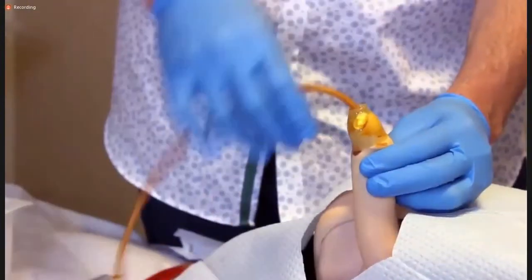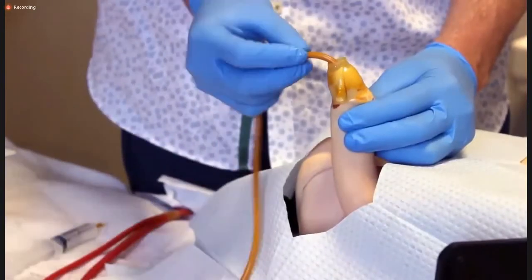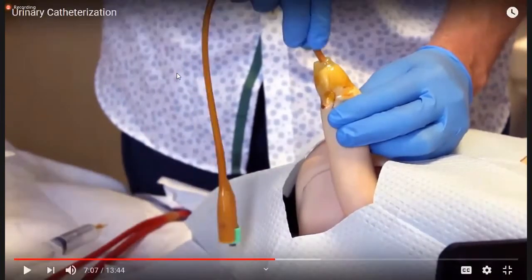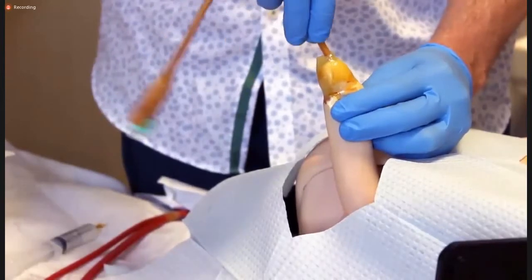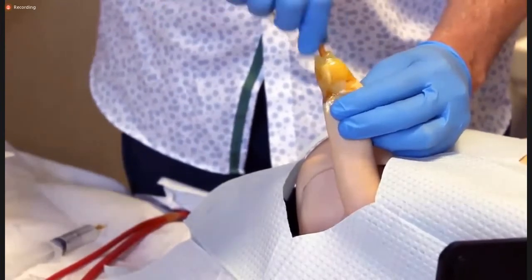And then, the key thing is not to grab halfway down the catheter. You want to very firmly, with very short sections, advance the catheter into the urethra, very gently. So about a centimeter. Hold the penis with your non-dominant hand in an upward direction. A centimeter or 2 at a time, steady pressure. Because if you grab too far back, it's going to buckle, and you won't be able to get the catheter in. So a firm but steady pressure, 1 to 2 centimeters at a time, passing the catheter in through the urethral meatus with the penis on stretch throughout.